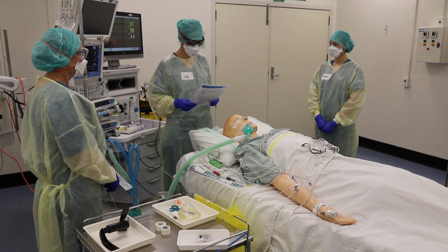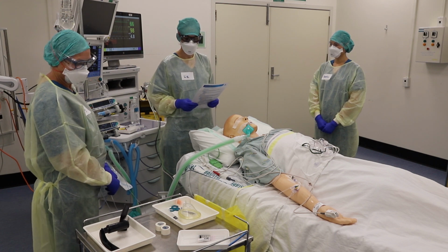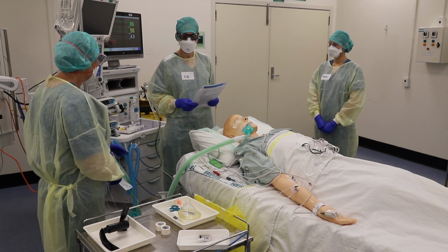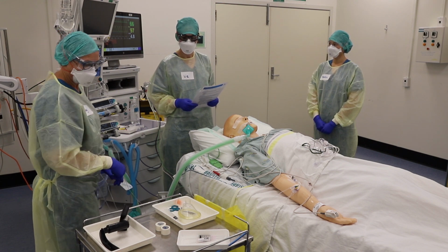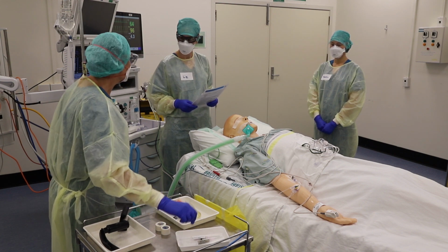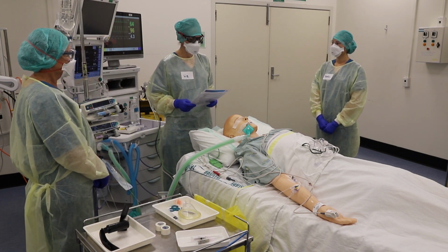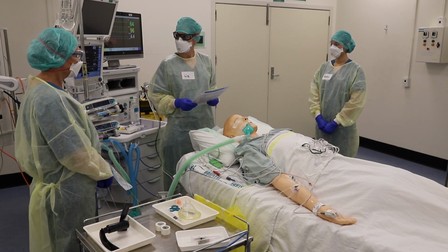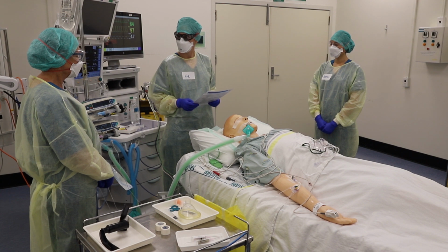We will plan to do what we can to minimise aerosolization. So, contingency plan for coughing: we've got some remifentanil running already, and Kay, I've got some lignocaine drawn up there that I'm going to ask you to give at the same time as the Sugammadex later. Great. If the patient looks at all agitated or things aren't going smoothly, then we'll have a low threshold to get the patient back off to sleep.